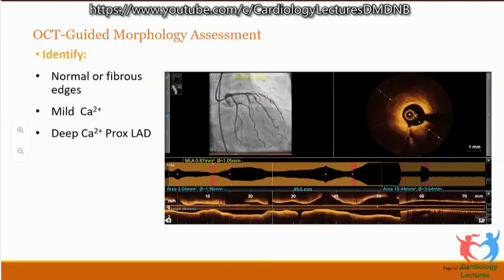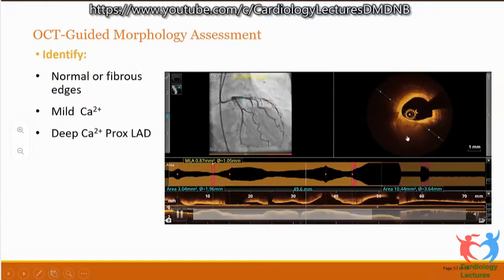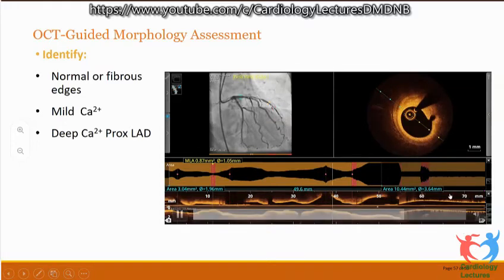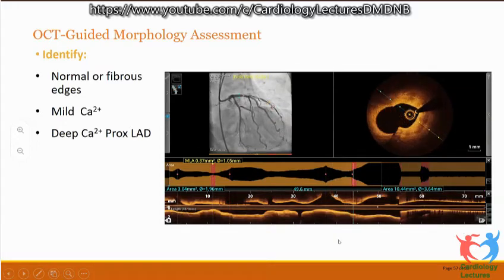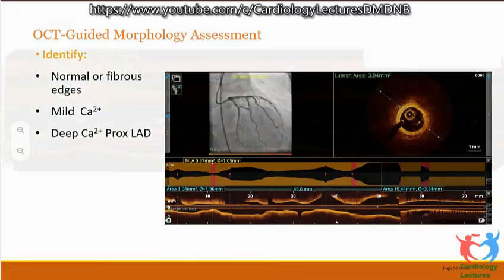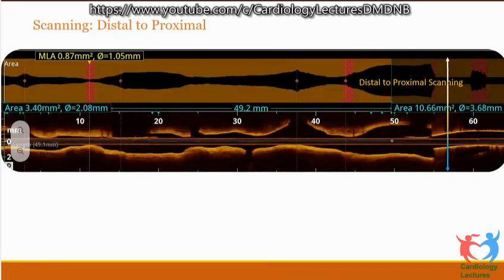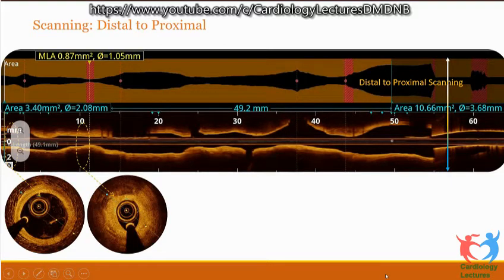Using NC balloons. So you can see now we are approaching the lesion and there is deep calcium. These are the calcific bits that keep coming and going. This is the proximal segment of the LAD and a branch coming out. So now we identify the proximal and the distal. This is the guide. We are trying to identify the segments. This was the distal reference.